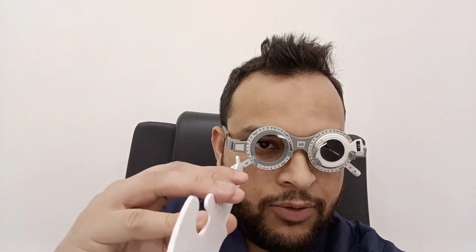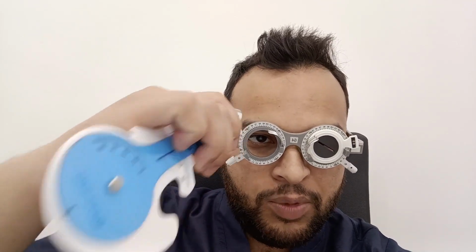Now to measure your back vertex distance, we have two methods. First, we tell the patient to wear the frame, and the second thing we need is a scale like this. We have to measure from here to the level of the cornea. I cannot measure it properly because I'm wearing this type of frame.